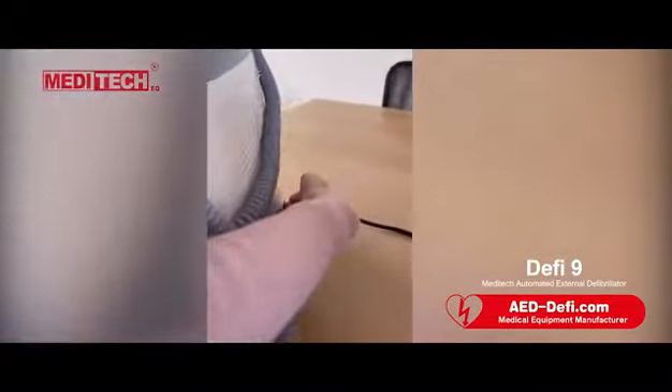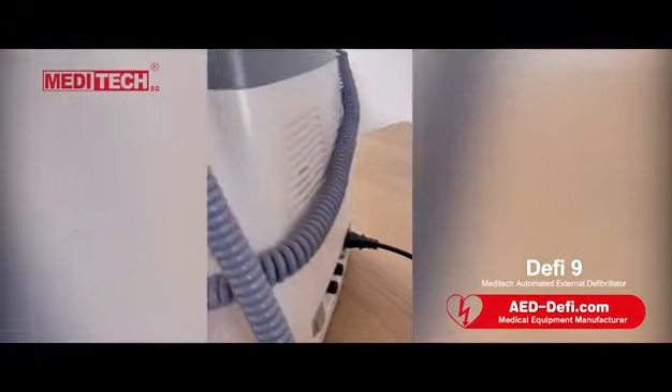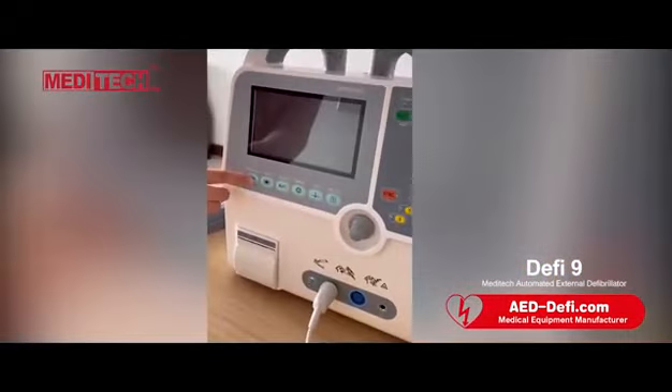Connect with AC power. Turn on this switch. Touch and hold this key.